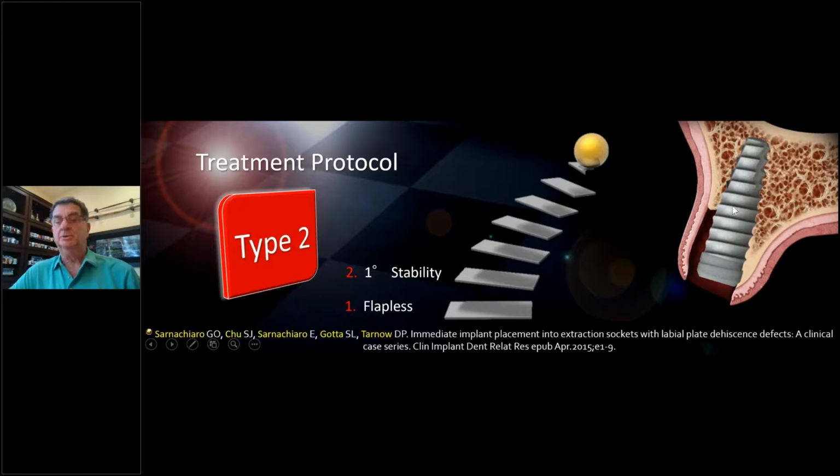You get primary stability going into the palatal root and up in the apical area. So we got good stability with a BioHorizon type of implant. Instead of a full temporary, he made a custom healing abutment, although now we can make a temporary too. We weren't sure at the time. This is like the top part of the ice cream cone, but you don't need it now. You're going to make an acrylic temporary to keep the tissue open, like the eye shell.